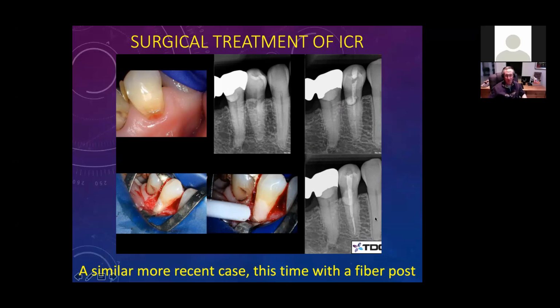So the way we do them is we prepare the canal to do the endo, and we don't take a twist drill and make the canal bigger. We fit a post into the existing space, so we're not removing additional depth to put a post in there. And so that's what we do pretty much routinely in single tooth anteriors and premolars, not so much in molars.